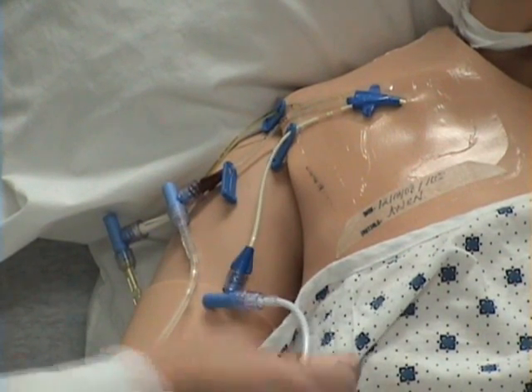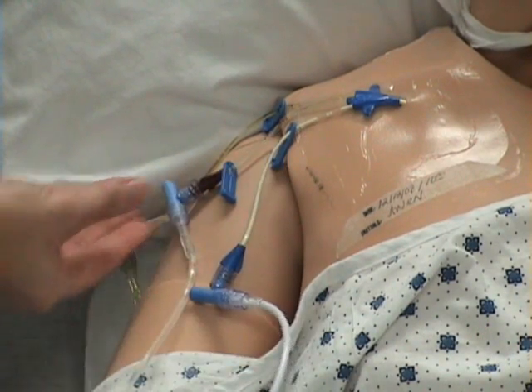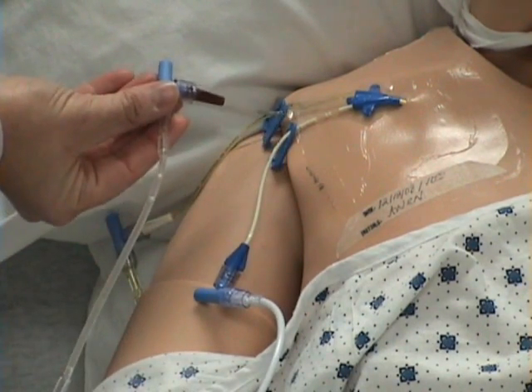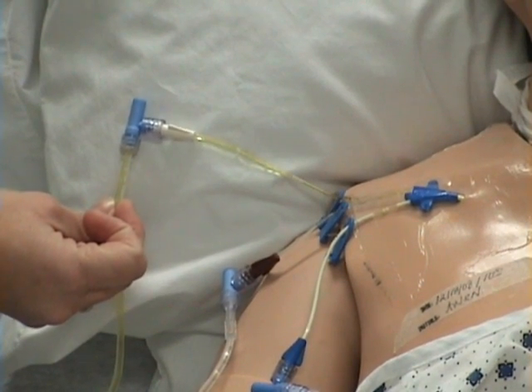As you can see, the HA is running through this line, the normal saline is running through this line, and the vitamin B12 is running through this line.